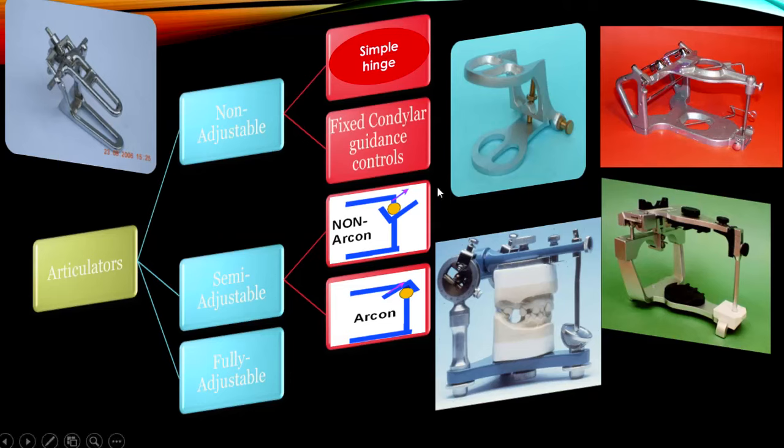The other type we have is semi-adjustable, either non-arcon or arcon.